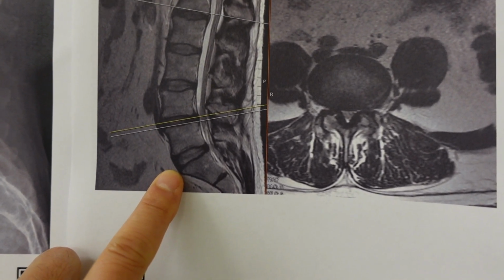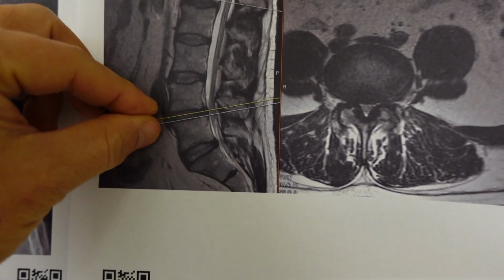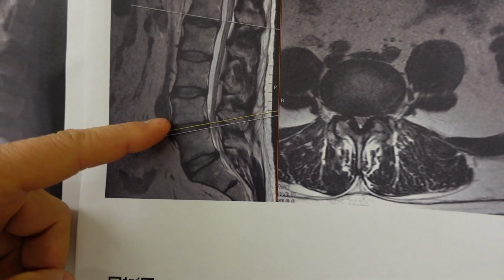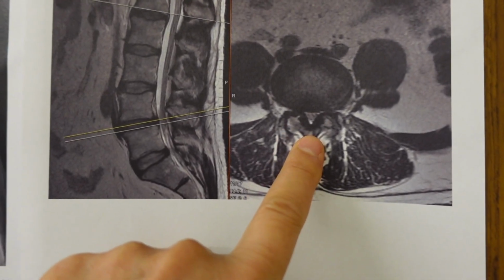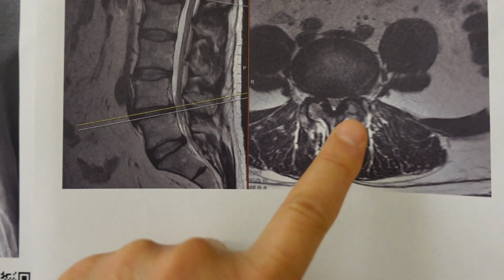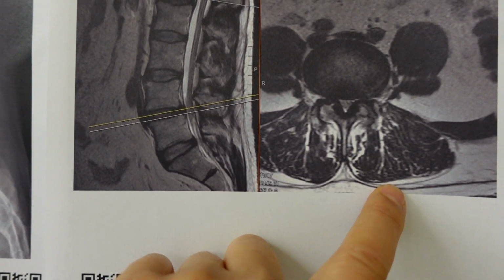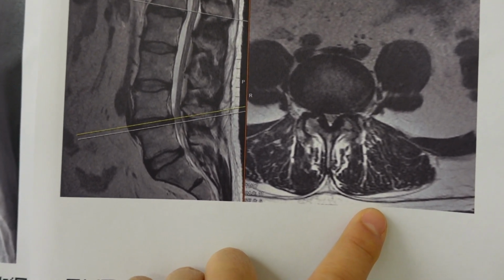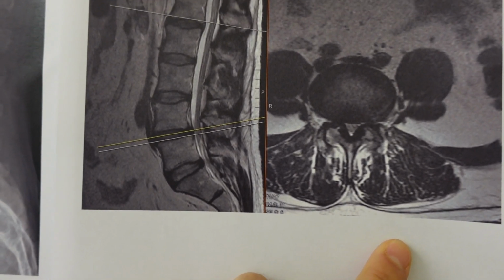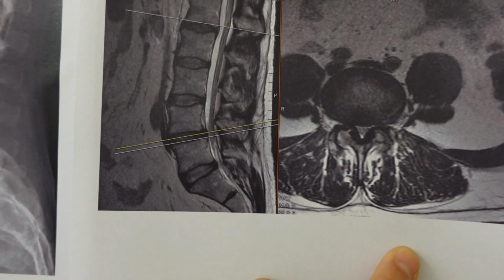Get a big implant in there and really provide stable fixation in the front, improve his lordosis and bring him back a little bit and stabilize him. And just by realigning the disc space, we will tension everything up and indirectly decompress the stenosis, and we'll be able to fix him from the back without exposing the dural tube and getting blood all around there. And I anticipate a great result, and if all goes well, he can either go home tonight or tomorrow morning.